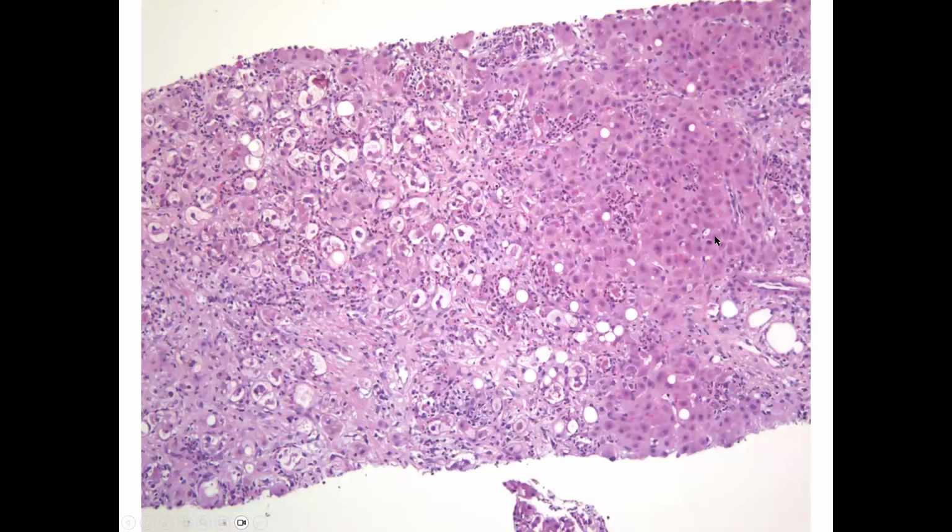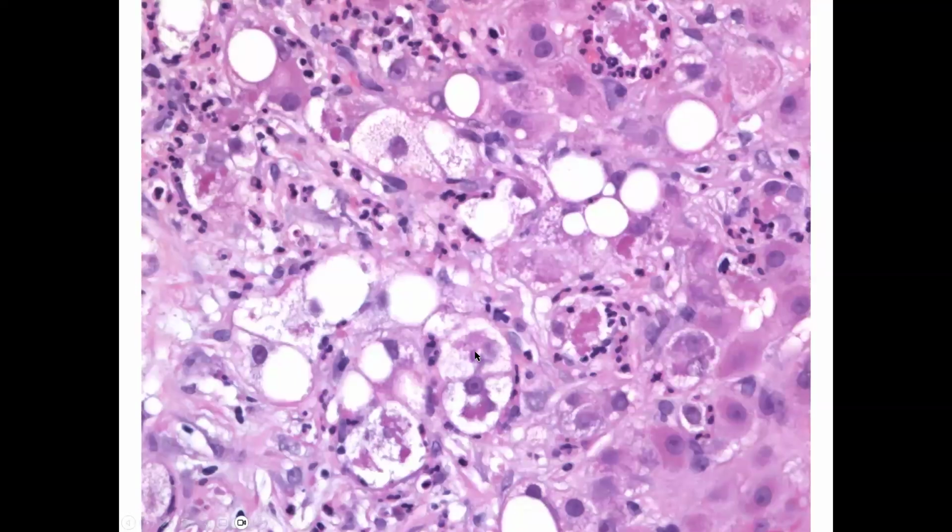This is another example where, even from low power, now that you know what a balloon hepatocyte looks like, you can kind of say, wow, those look like balloon hepatocytes again. Over here are some very regenerative hepatocytes. They have a higher NC ratio, less cytoplasm than normal. So this is an individual who had some very severe acute injury, and so the surviving hepatocytes here are really, really regenerative. Let's take a look at what these look like on higher power.